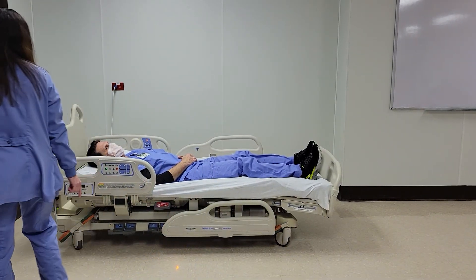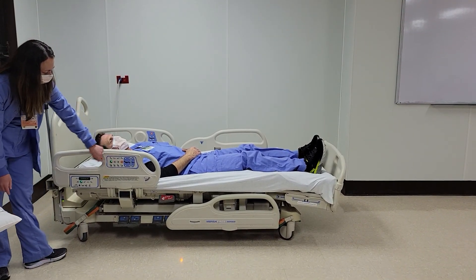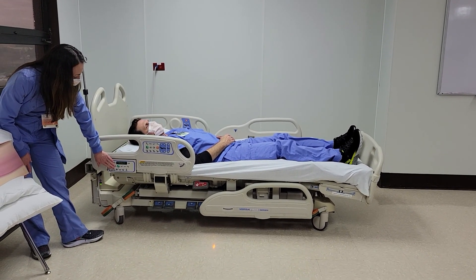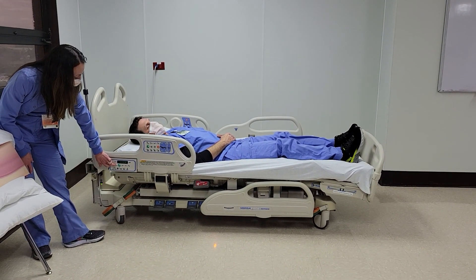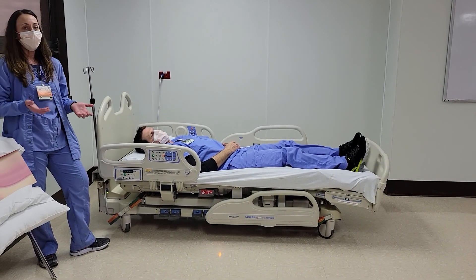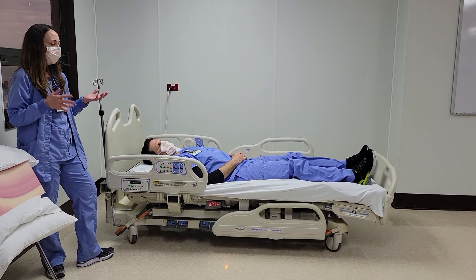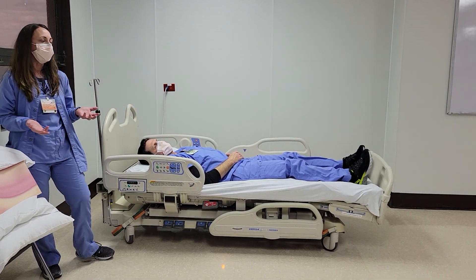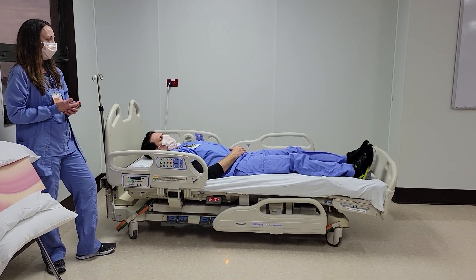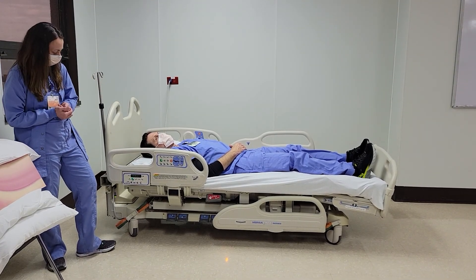All your controls are here — if there's a key next to it, you have to hit the key to activate any of the buttons. Another button that's easy to use is the max inflate. This is helpful when you want to reposition the patient in the bed and give them a solid surface. If they're sitting on the side of the bed to eat meals, a quick push of the button inflates the bed to a firm surface so they're not tilted or leaning. It has an automatic timeout.